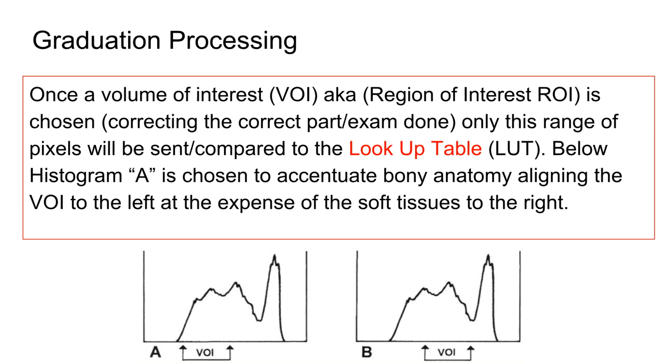So there are some rules like that, but the rescaling process has already occurred. Now, if a radiologist or whomever wants to still tweak the image, they're perfectly able to do that. But they may not be able to get back to the raw data completely, which is why we have to be careful about just trying to make the image look pretty on our monitor when it goes to some much fancier workstation, after you click it into PACS.